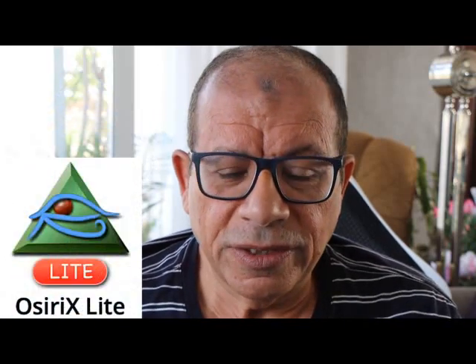I started publishing some of my operative data, audio and video, and I posted it in channels on Facebook and YouTube, and now I'm going to introduce you to one of the important software on Apple system. This software is OsiriX.